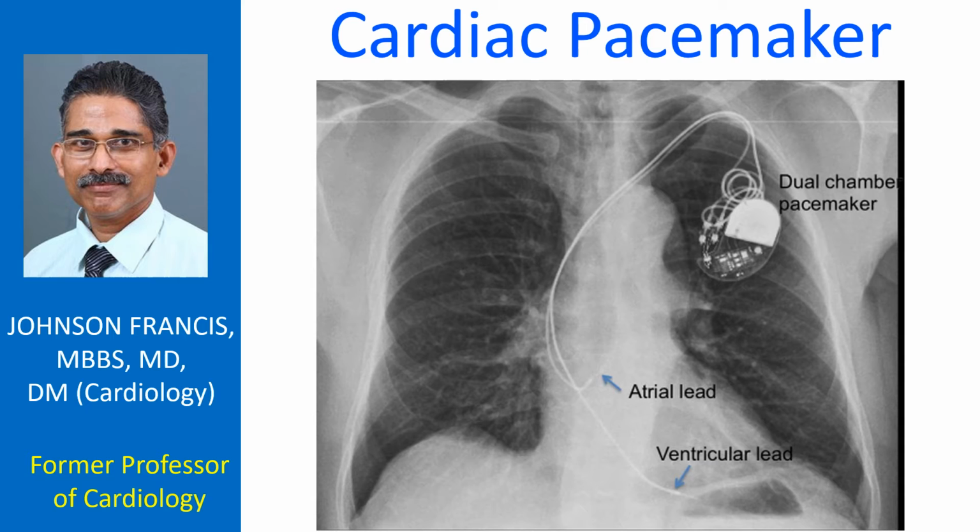The basic electronic pacemaker consists of an electronic circuitry to generate the pulses, a battery with long storage life of the order of several years, and a set of leads to convey the pulses to the heart. The battery and circuitry are housed together in a hermetically sealed metallic container made of biocompatible material which will not induce a foreign body reaction in the body. This part, known as the pulse generator, is usually implanted under the skin under local anesthesia.